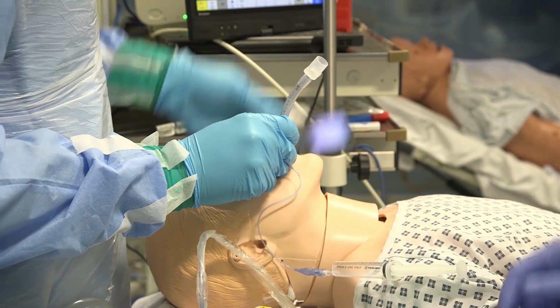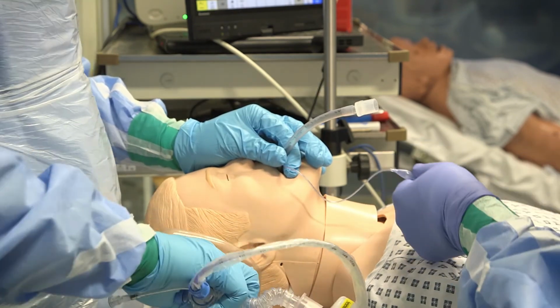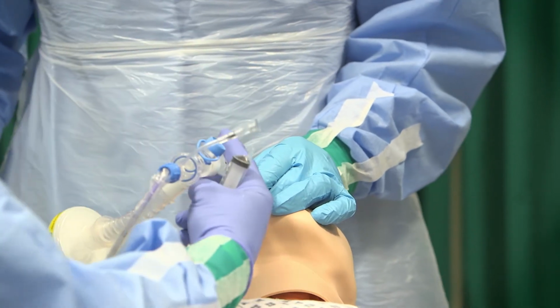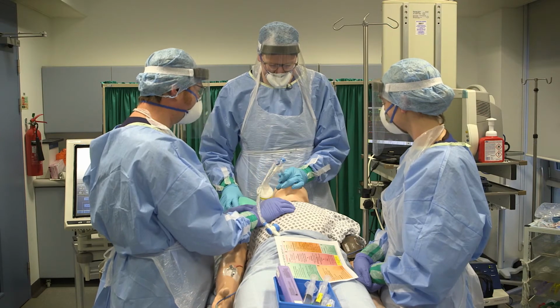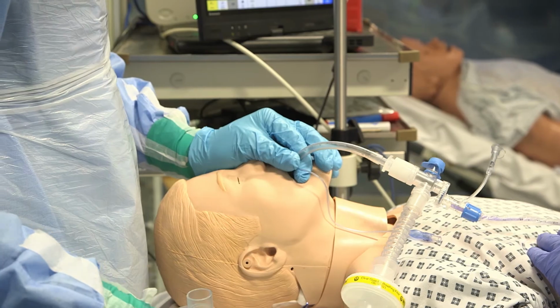Thank you. Cuffs inflated. Okay. Confirmed clinically, we have bilateral chest movement and we have end-tidal CO2.